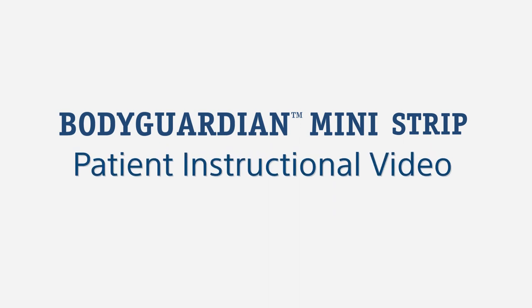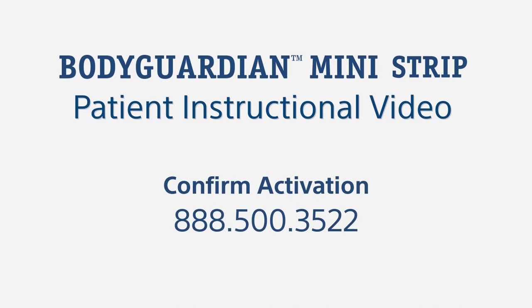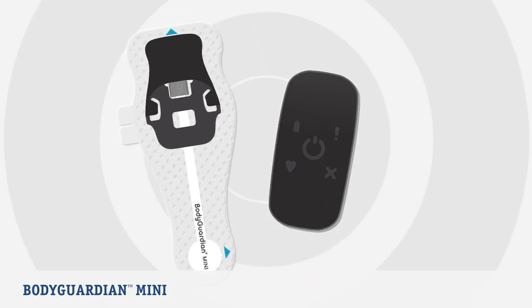Welcome to the BodyGuardian Mini video for patients using the BodyGuardian Mini with strips. If you've received your monitor at home, call now to activate your service at 888-500-3522. This video will walk you through the process of setting up your monitor and tell you more about what to expect during your monitoring period.